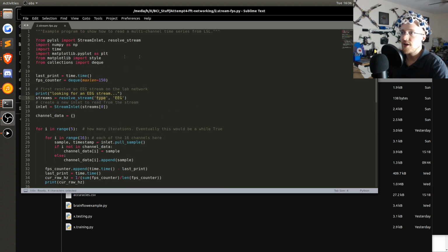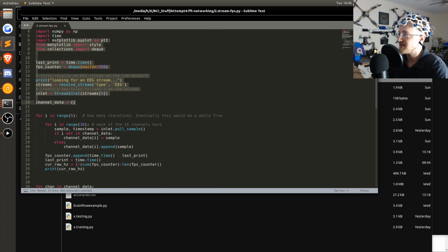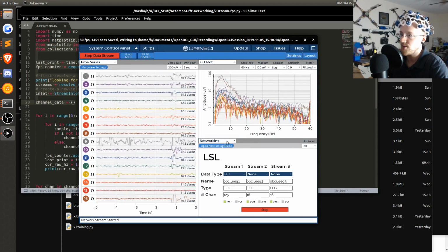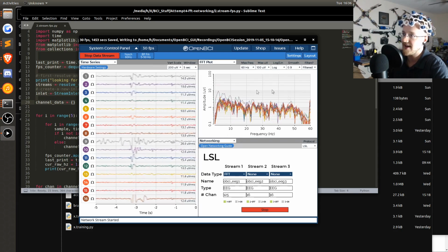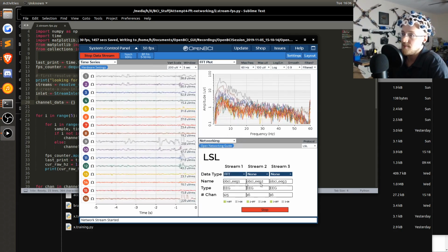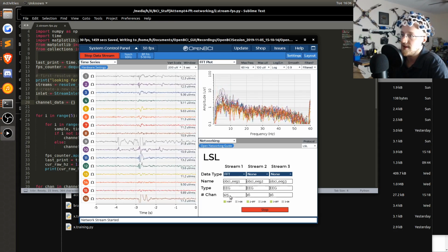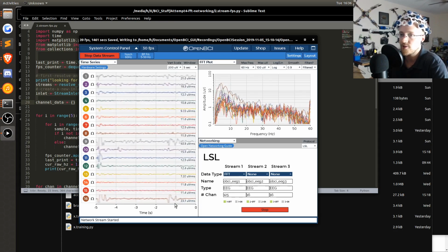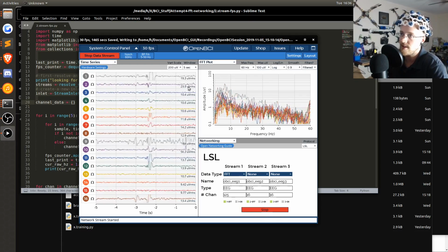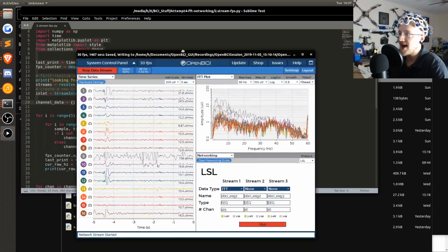Okay, so this was kind of the first code that I grabbed to get the LSL data to get the FFT, or fast Fourier transform, graph, which basically is this data here. So again, you just choose that type. You can name it and type it here, and then you say 125 channels because we're sampling at 125 hertz, and then you just hit start here. So once you've done that, you're done, right?